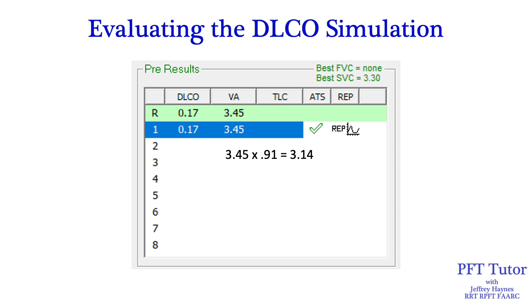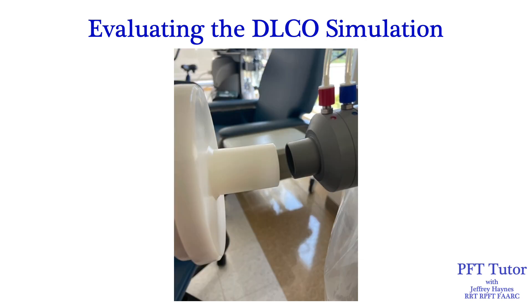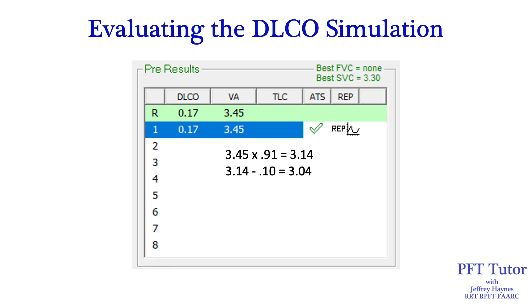However, it's still not really close to 3 liters. Remember that even though we are performing this simulation without a hose or filter attached to the syringe, there is still some dead space in the syringe that needs to be accounted for. For this syringe, the dead space is 100 mL. So if we go back and subtract an additional 100 mL for the syringe dead space, the simulated VA is now 3.04 liters — very close to the 3-liter target.